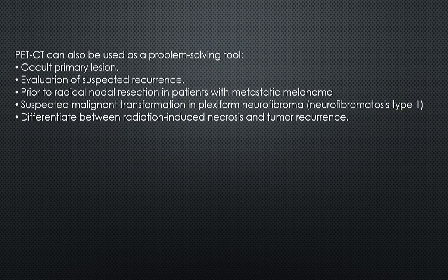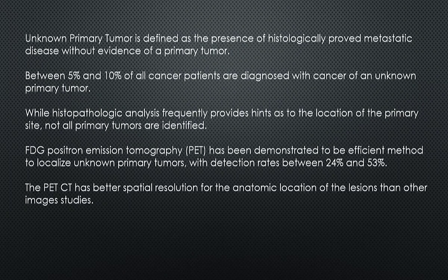And PET-CT is a problem-solving tool for occult primary lesions, evaluation of suspected recurrence prior to radical nodal resection in patients with metastatic melanoma, suspected malignant transformation in plexiform neurofibroma, and differentiating between radiation-induced necrosis and tumor recurrence, okay?